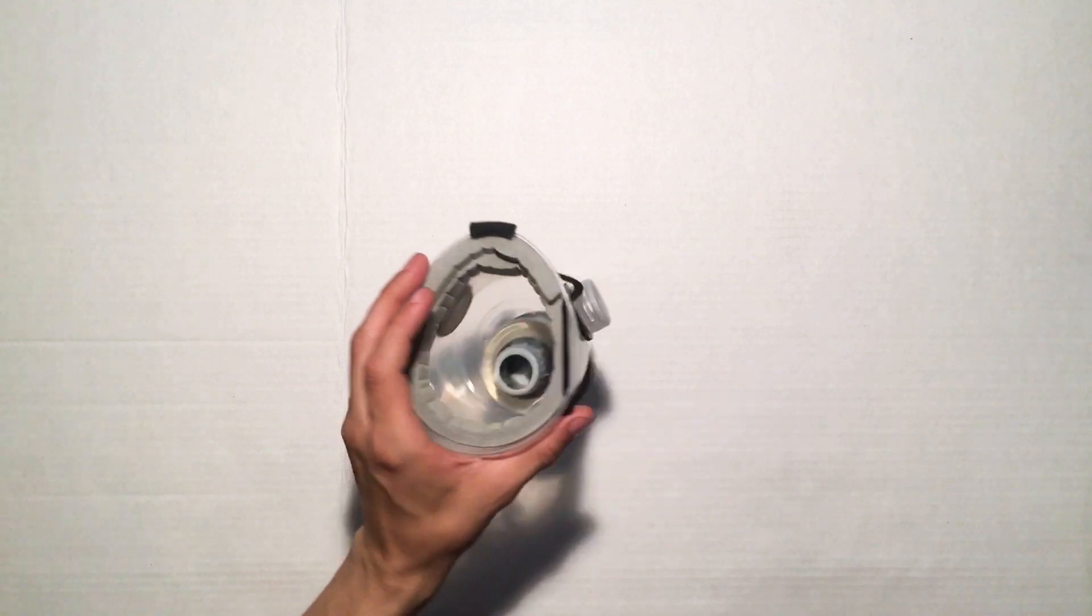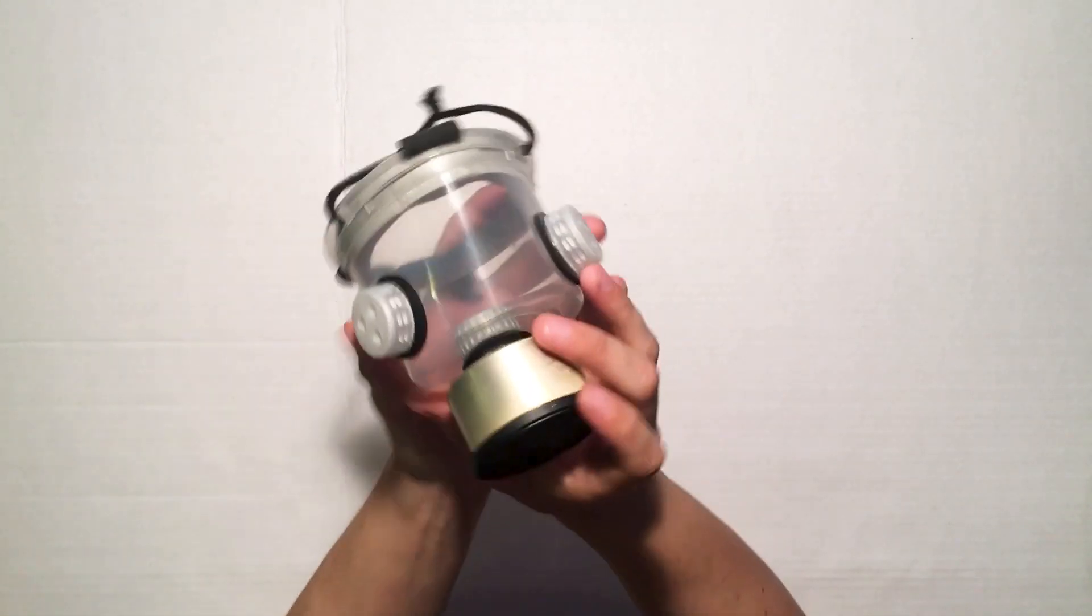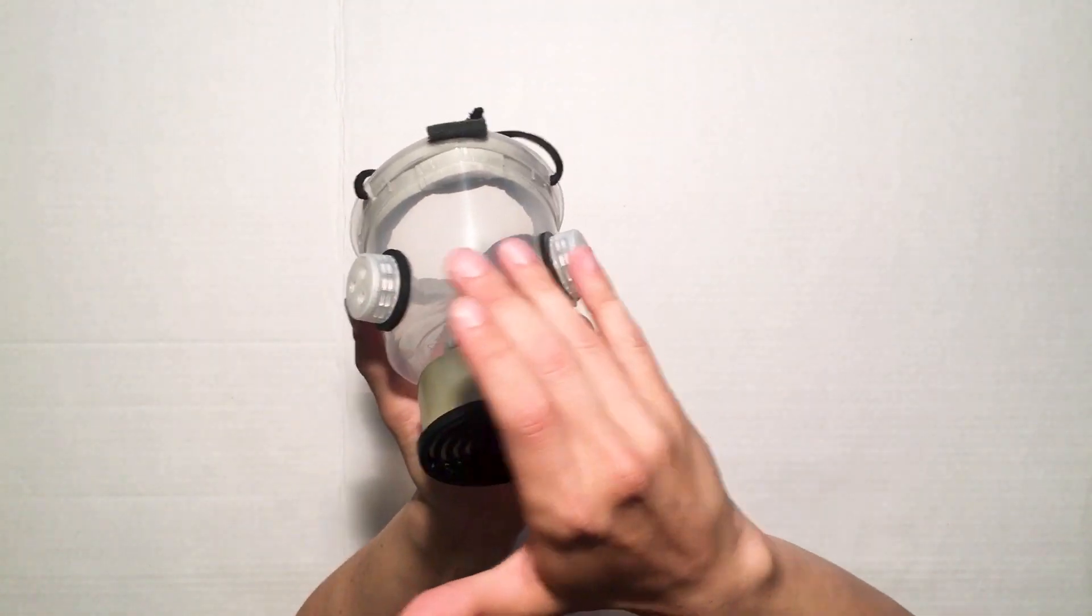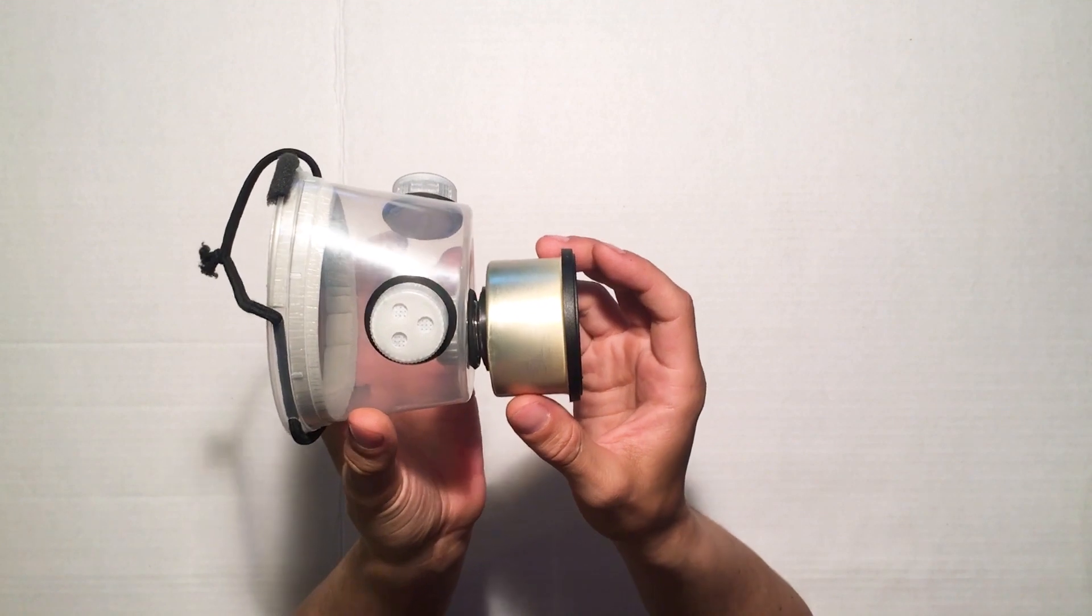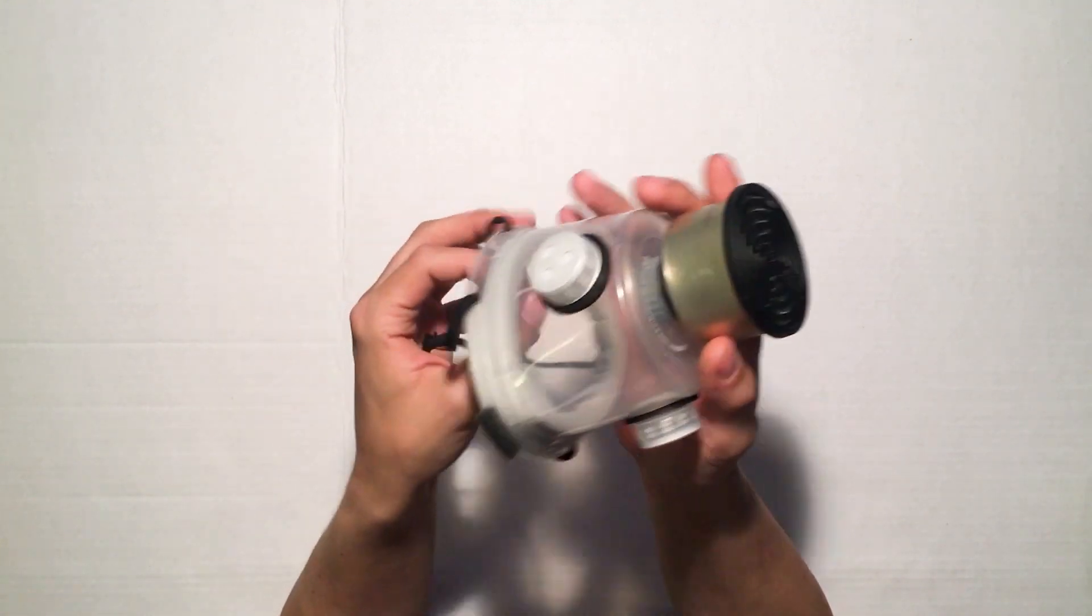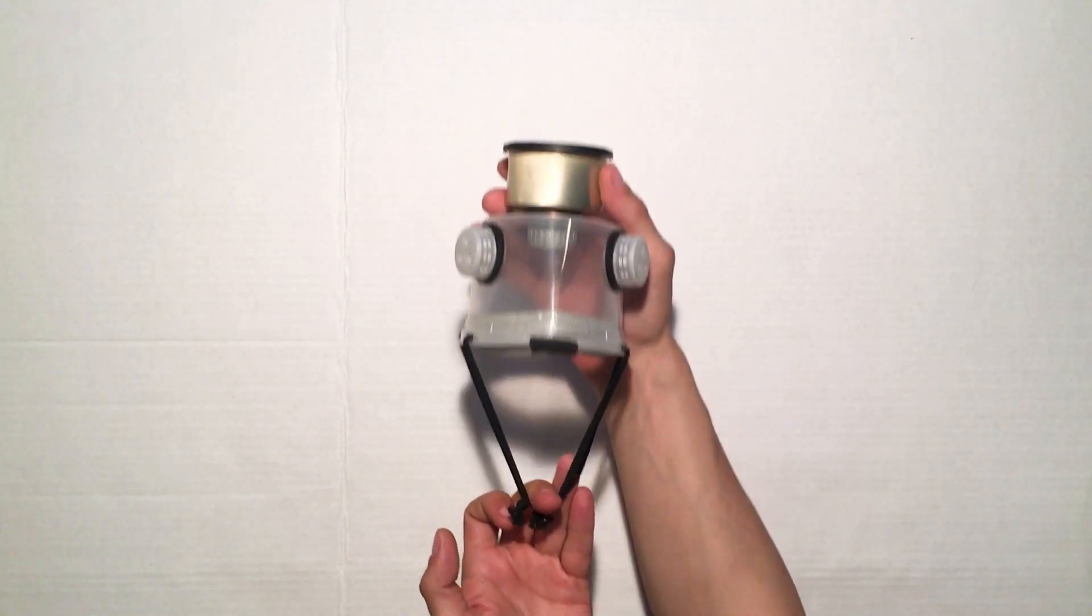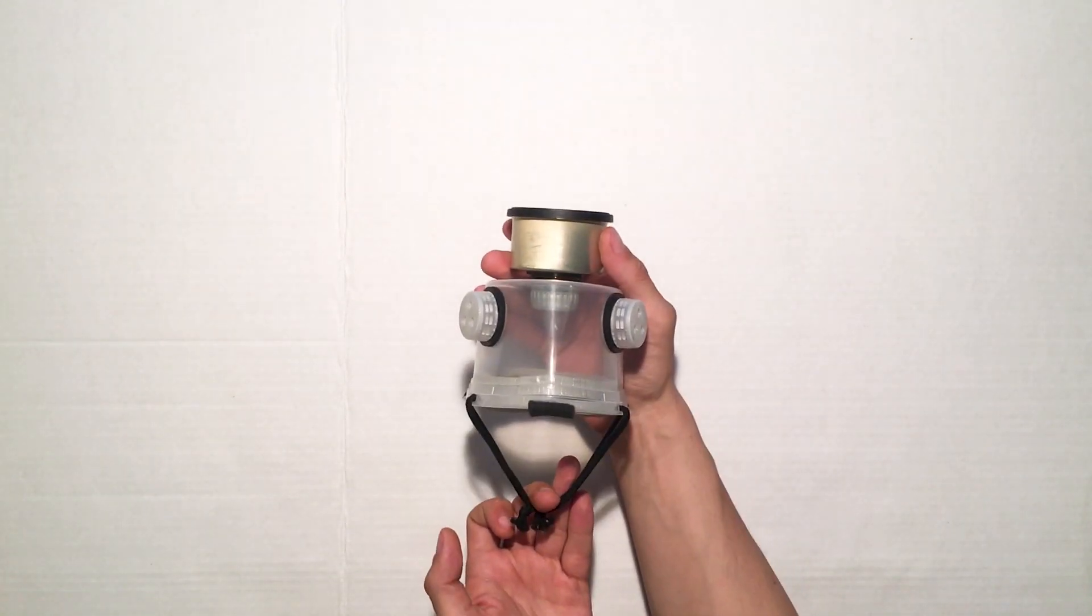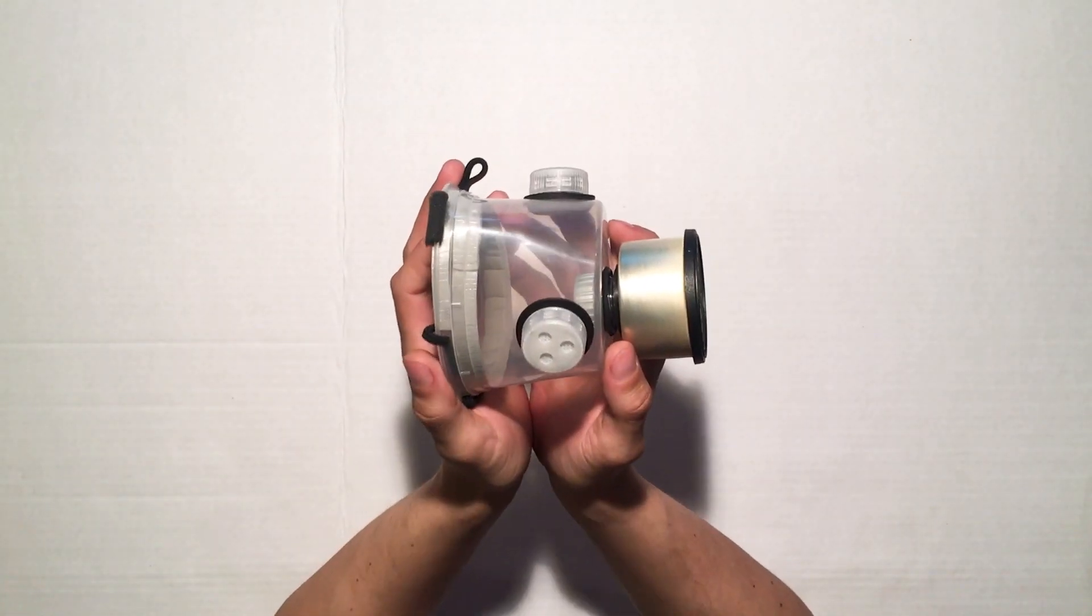By now, you'll have noticed there are two valves at the top of the mask. They are made from soda bottles and they act as exhalation valves, so the mask will not lift off your face as you breathe out. And it will stop your glasses or your goggles from steaming up.